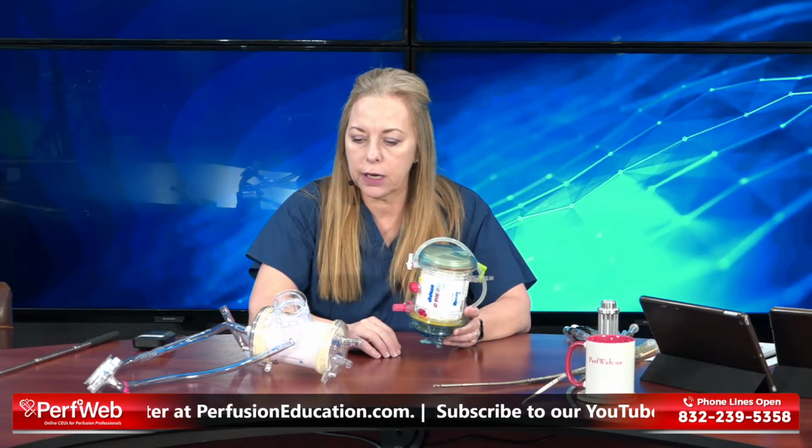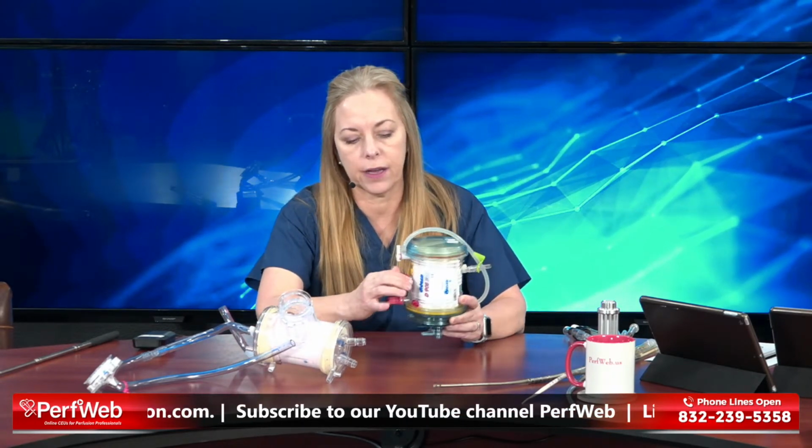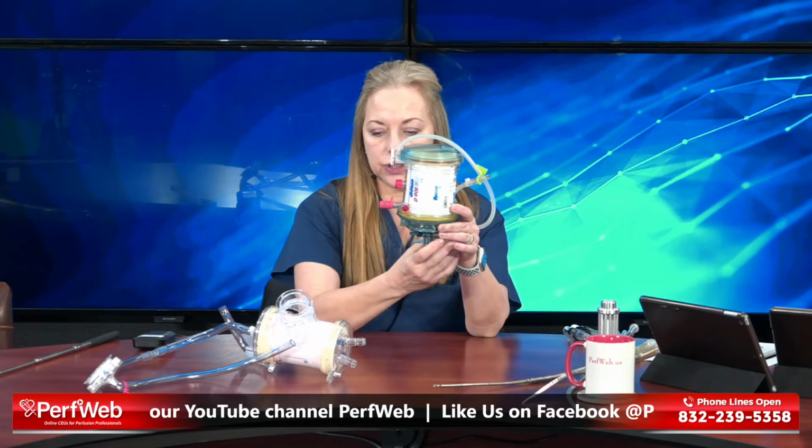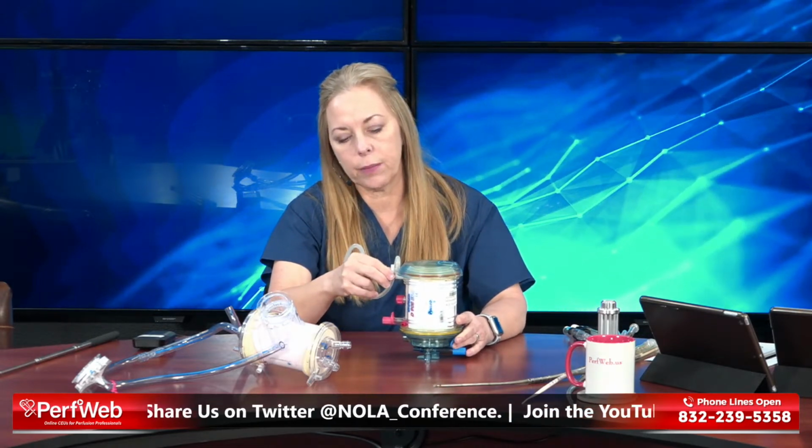They're both very similar in that they've got these extra ports here if you needed to have an extra line. I think they're actually developed for cardioplegia. They have heat exchangers inside of them. This one's located here. This one's underneath, so that we're able to warm and cool the patient as needed. They both have recirc lines that come off of them. This one is here, and you can open it, it has a little bit more adjustment. You can have a full flow coming out or a trickle flow or turn it off completely. This one as well, although it doesn't have that same adjustment.